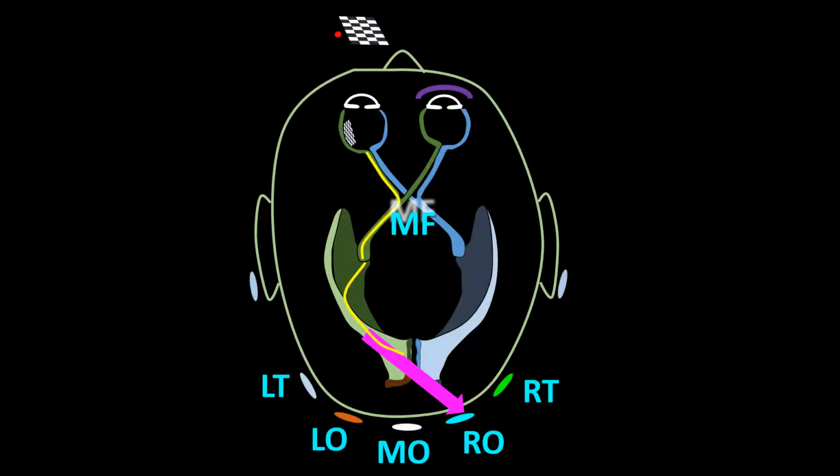So, stimulation of the right visual field of the left eye produces a field with the highest intensity on the right occipital electrode. And right visual field stimulation of the right eye produces an energy field with the same characteristics.